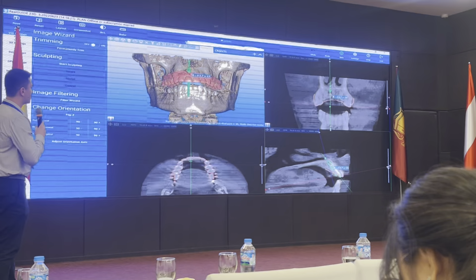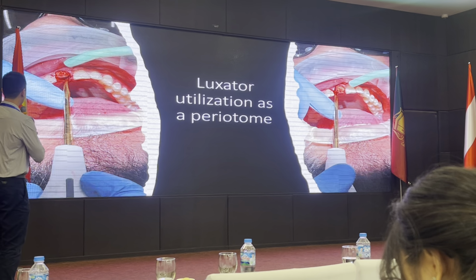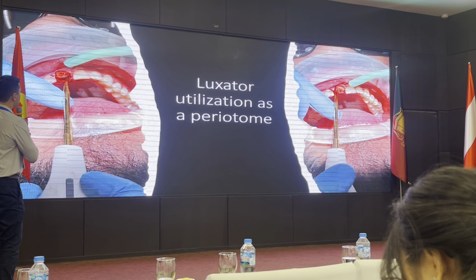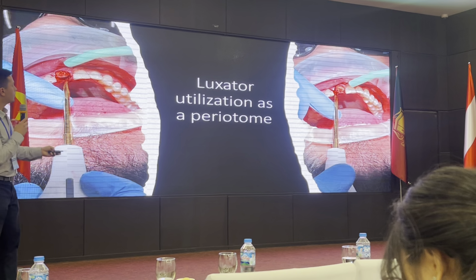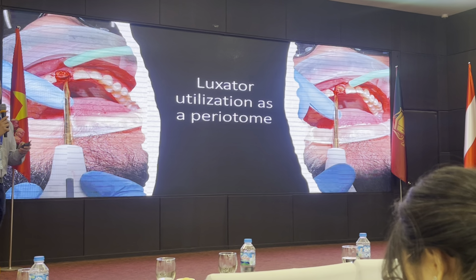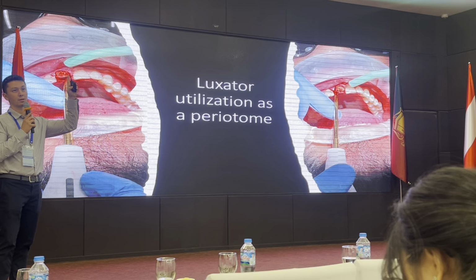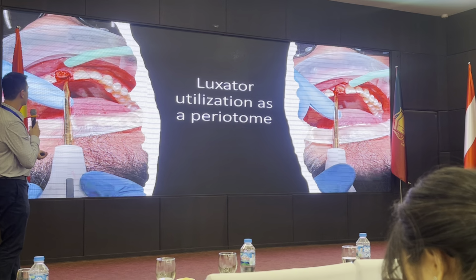With all these things put together, this is the technique that I've found very successful. We're using what we call a luxator, which is that straight elevator, and I'm pushing on the mesiolingual and the mesiofacial line angles. Just moderate pressure. I'm not trying to push real heavy. Notice the tip of this instrument is very sharp. This is where focus and control of your instrumentation is going to help you have a successful implant surgery. Because remember, patient safety is number one. We have to make sure we keep the patient safe. Do no harm. So we're gently elevating that tooth out.